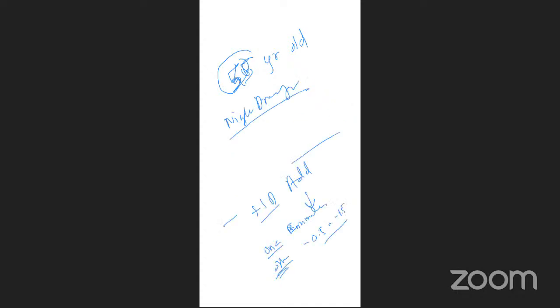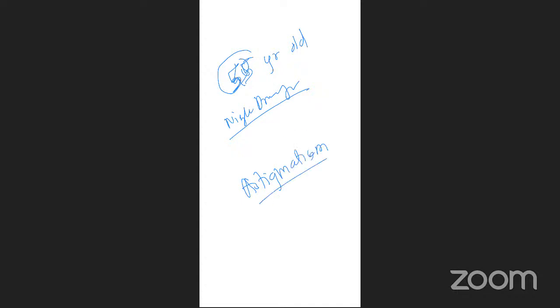Whenever you are doing CLE, we have to make sure that retina is okay, and also we have to look at the astigmatism very carefully. Because most common residual errors after doing cataract are astigmatic errors. Now the spherical errors have reduced significantly because of the optical biometers that we use. But astigmatic errors can occur because of pre-operative astigmatism, existing astigmatism, or can be induced by the surgical induced astigmatism. So we have to be carefully watching for the astigmatic correction.